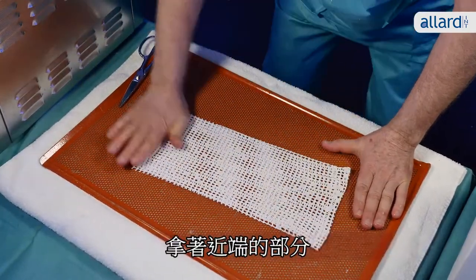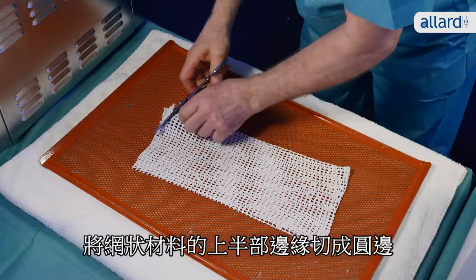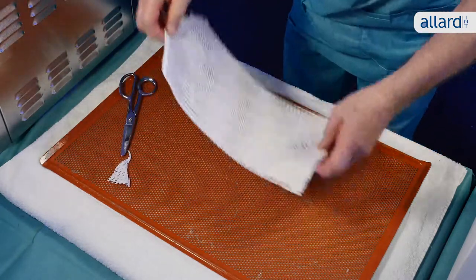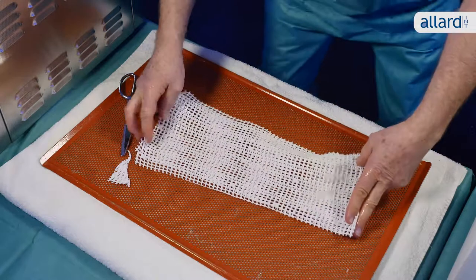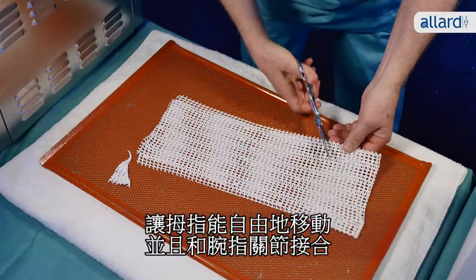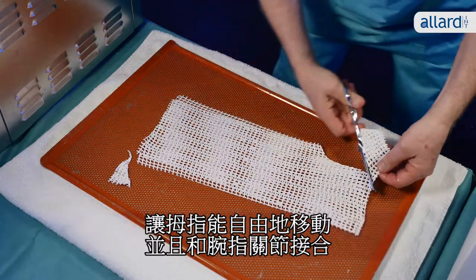Take the proximal piece and cut a nice rounded edge for the upper part of the splint. Cut the second piece of the splint to allow free movement around the thumb and a nice fit for the MCPs.